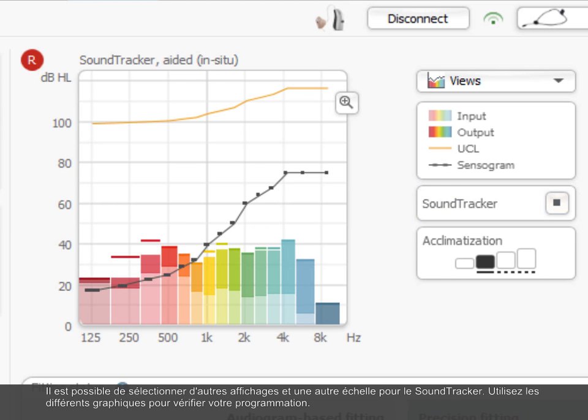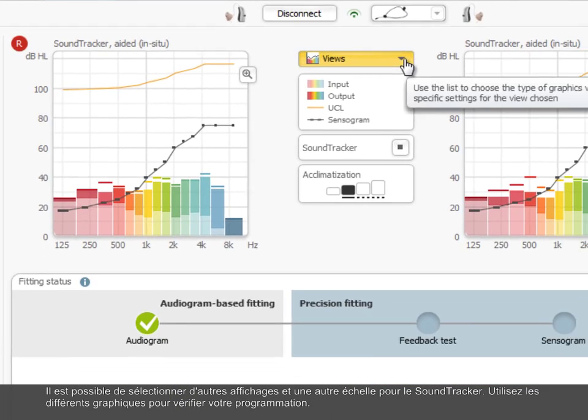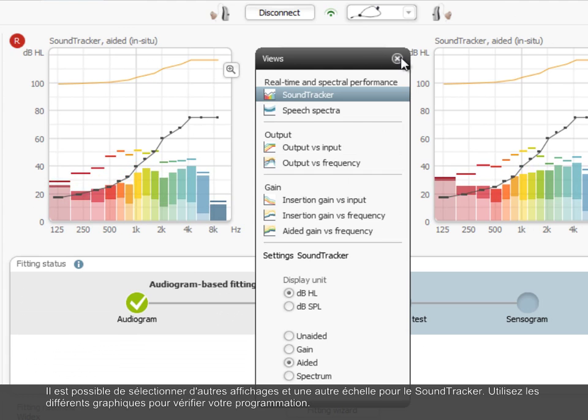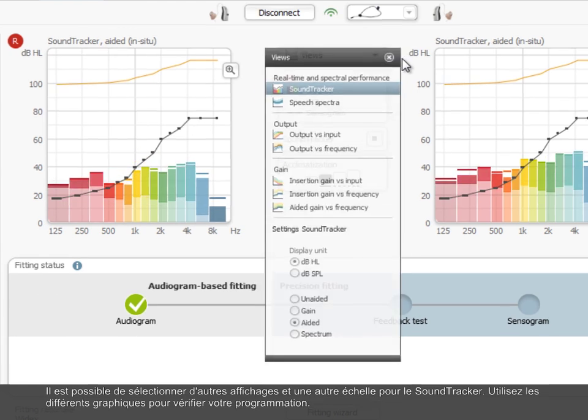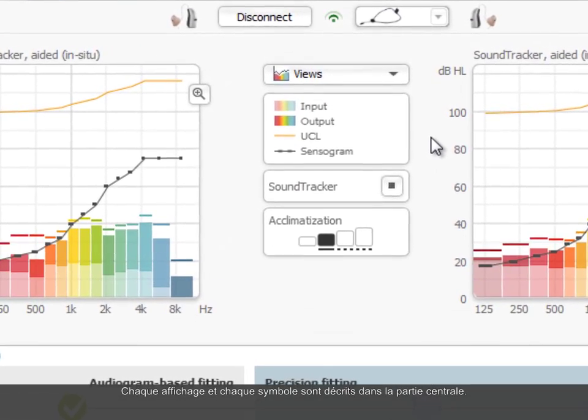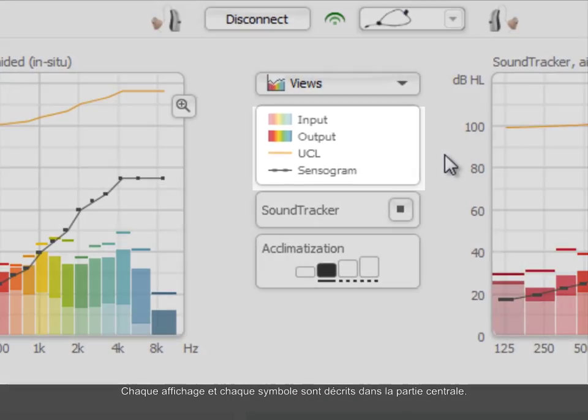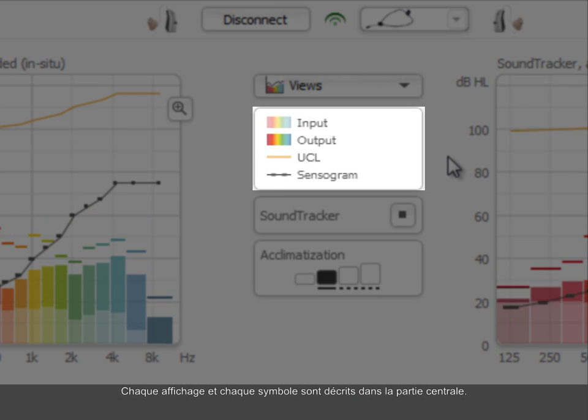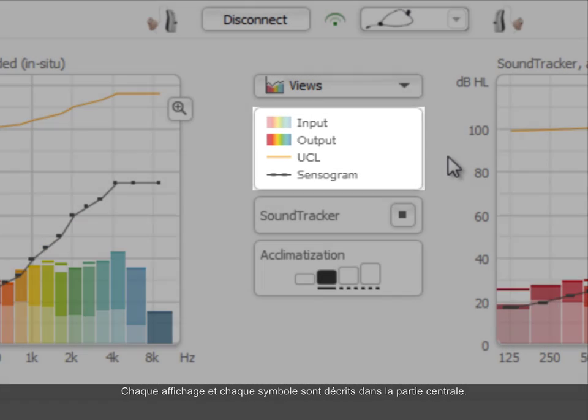Alternate views and scaling for the sound tracker are selectable. Use the various graphics to verify your fitting. There is an explanation for each view and symbols are provided in the area in the middle.